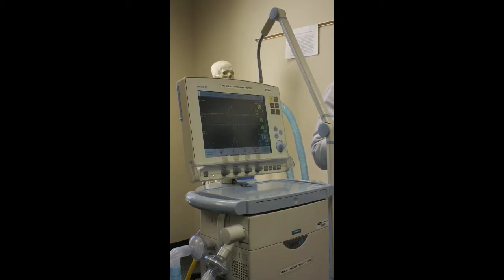If you're in pressure control, are you going to have a VT? No. Do you leave it blank? No, you put a line through it or NA. Never leave anything blank. If you leave something blank, it makes me question, does something belong here and they forgot to put it. A line through it or an NA, I know you accounted for it and it doesn't apply.